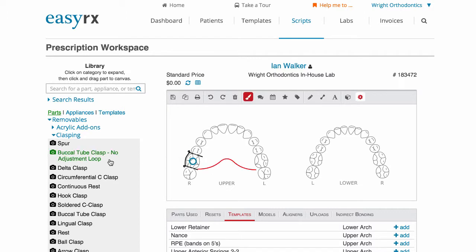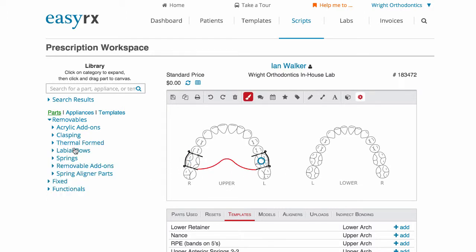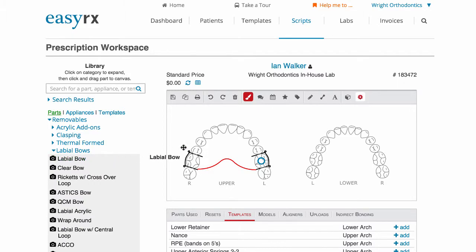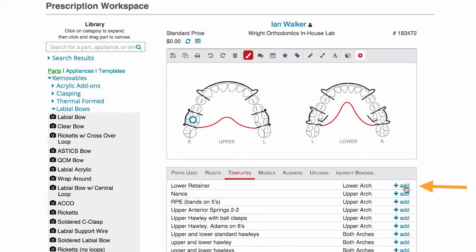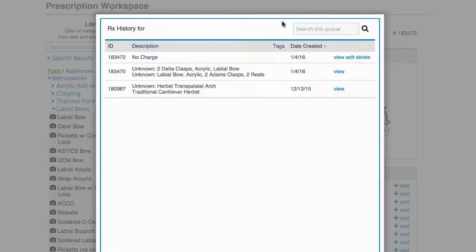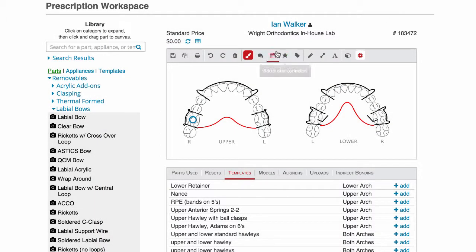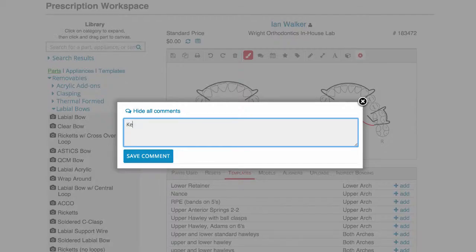In this case, we're designing an upper and lower Hawley. With our universal parts and appliance library, you can choose from hundreds of pre-drawn parts to create any of your appliances. You can also choose from one of your pre-designed templates. For reference, you can view this patient's previous RXs by clicking their name.